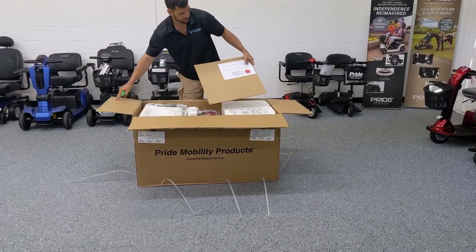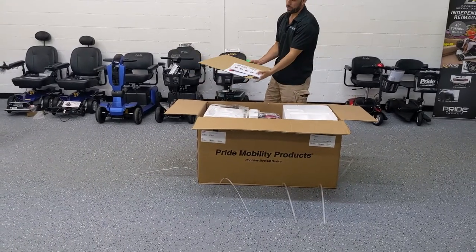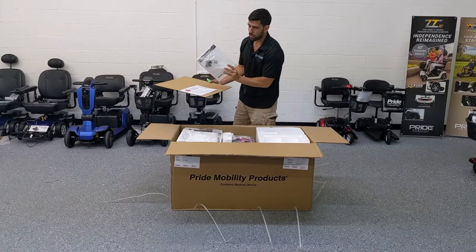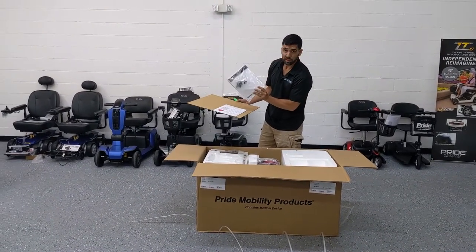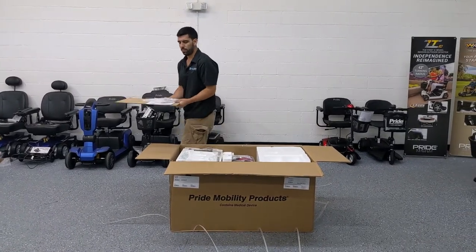At the top we've got a safety pamphlet, the user manual which comes with the keys, a pin for the seat post, and two pins for the arm wrench. I'll set that off to the side.